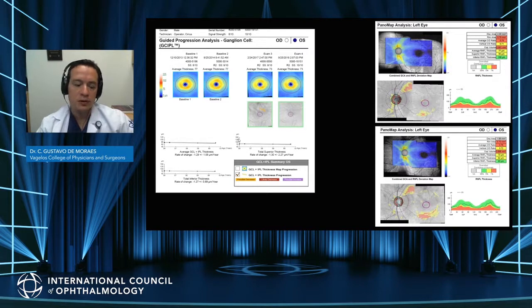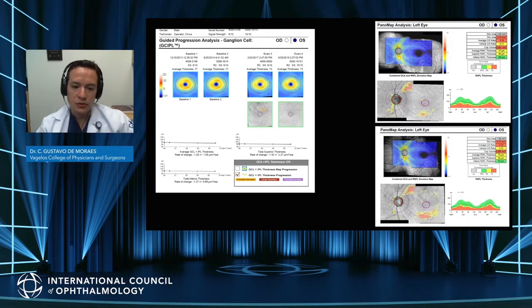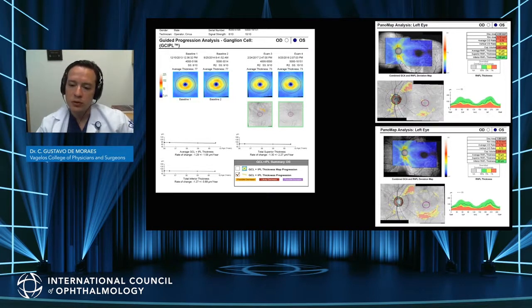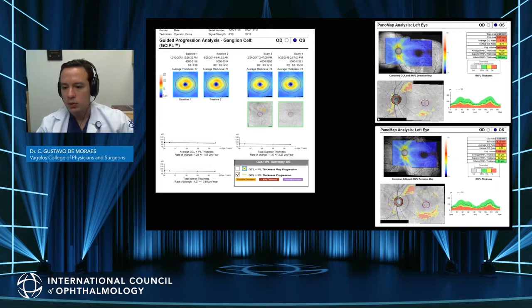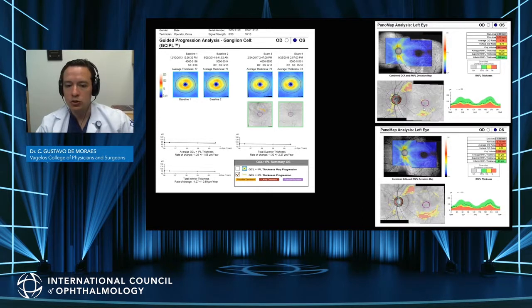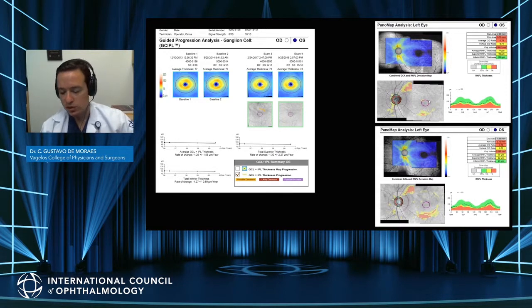Looking at the macula is also important. We can look at both event-based and trend-based analysis of progression. In some patients, you may not see much change in statistical analysis, but looking qualitatively and considering the topographical nature of glaucoma, you can see significant thinning of the inferior macula between scans. In the absence of multiple tests for trend or event analysis, it's recommended to look at individual scans and compare where progression occurred and whether it matches other tests such as visual fields.